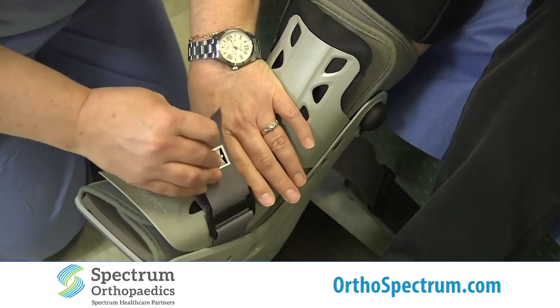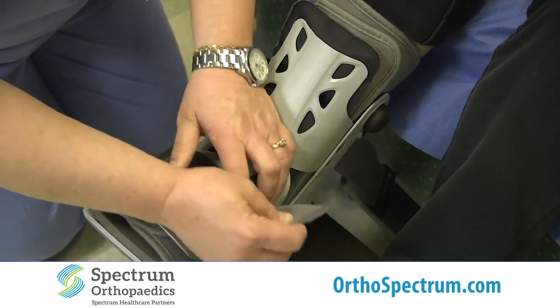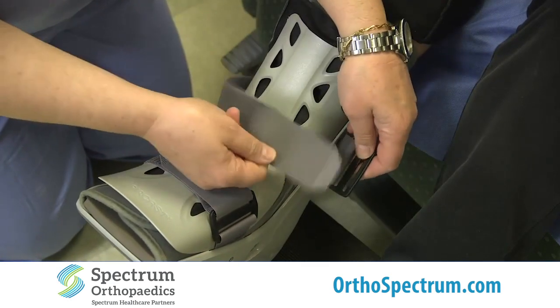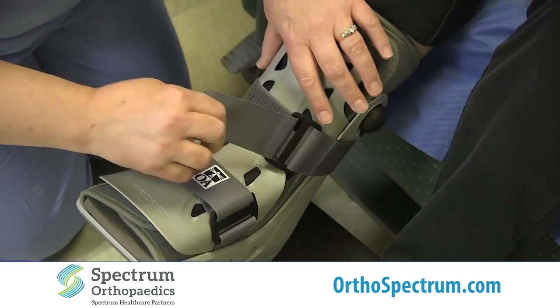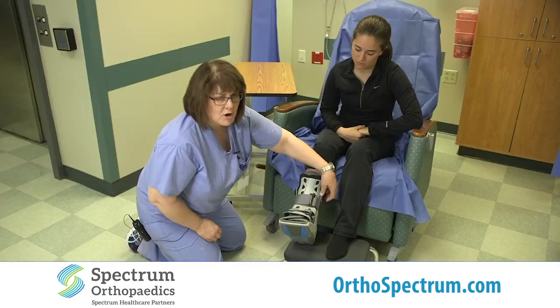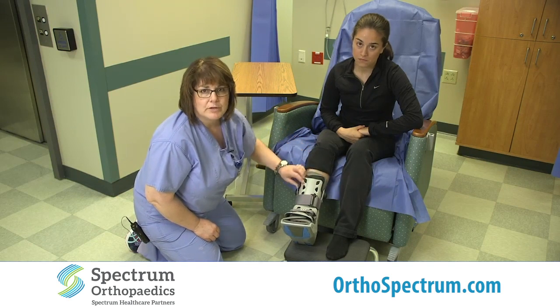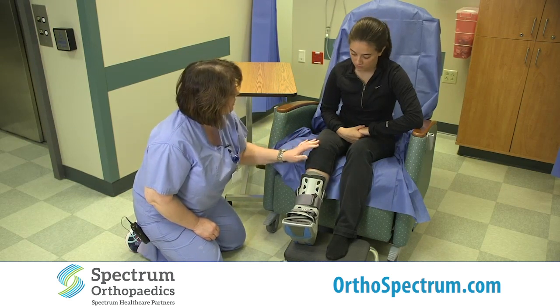That's the way this is designed to go. You would pull your velcro across — not very tight, just enough to keep it in place — and inflate the bladders so that your foot does not slide around in the boot. Does that feel comfortable? Yes.